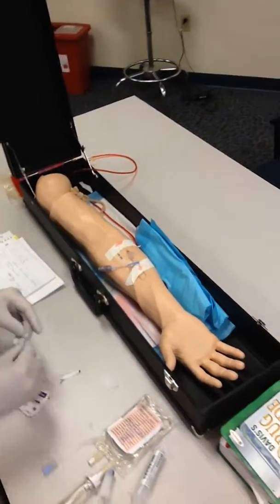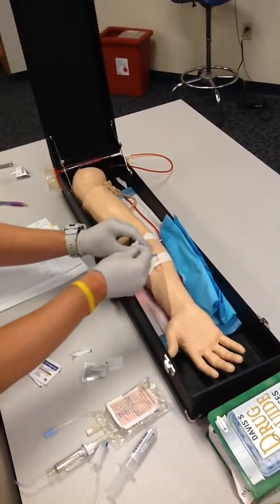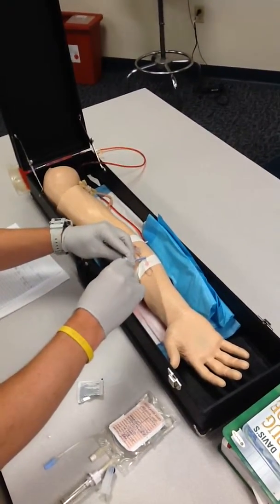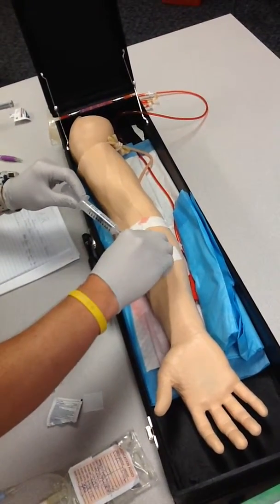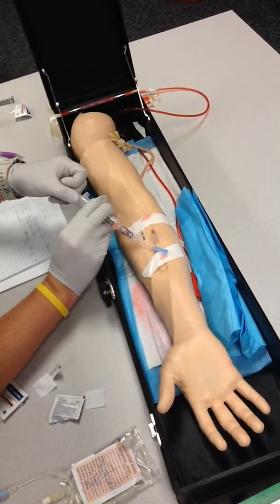So the site looks good. I will prepare an alcohol swab here to cleanse the end of the line. I have my flush here. I will connect my flush. I will open the pigtail. I will pull back. I see blood return.